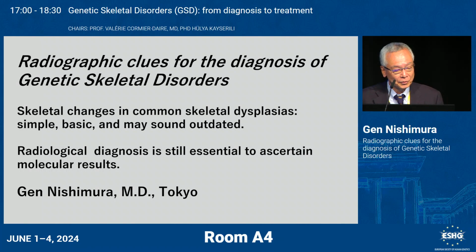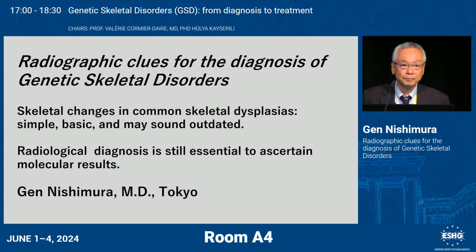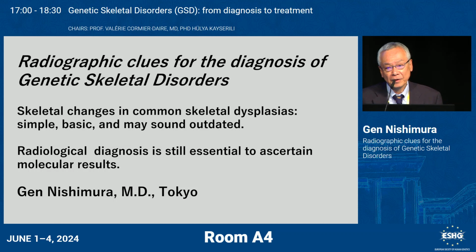Let me talk a little bit about skeletal changes in common skeletal dysplasias. My talk is very simple, basic, and may sound a little bit outdated. However, radiological diagnosis is still essential to ascertain at least molecular results.